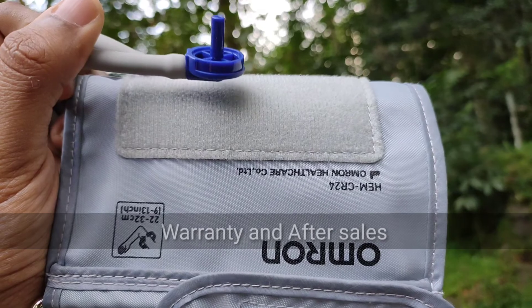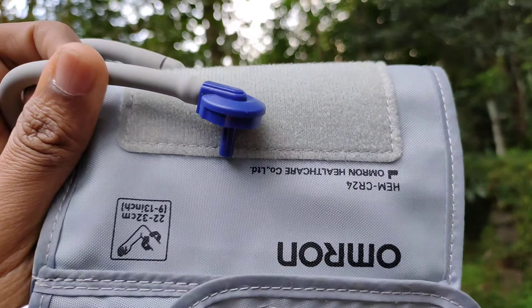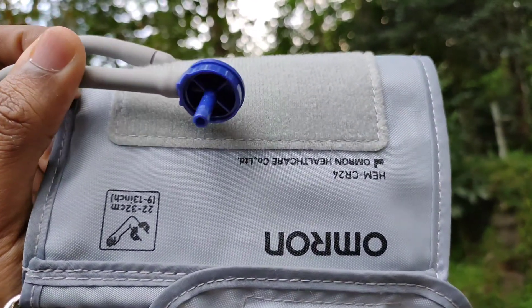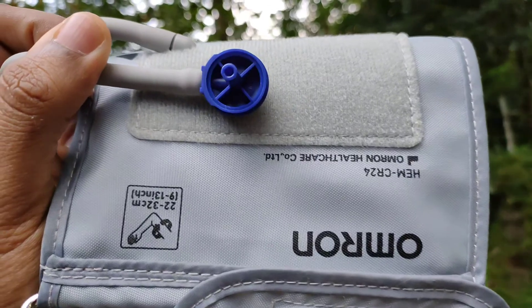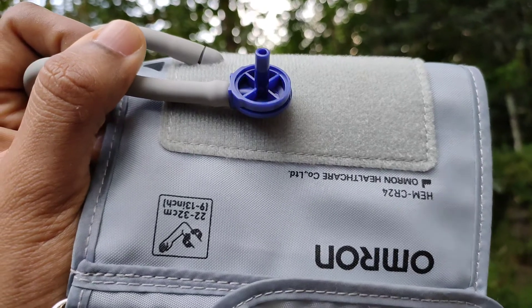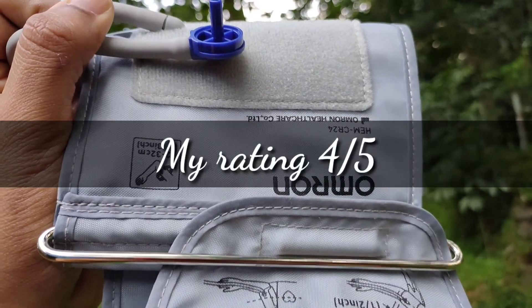When I ordered this product from Amazon, a 5 years of warranty was clearly mentioned in the product description but now they have changed it to 3 years, so I really doubt the after sale service. Based on the user experience, my rating for this product is 4 out of 5.